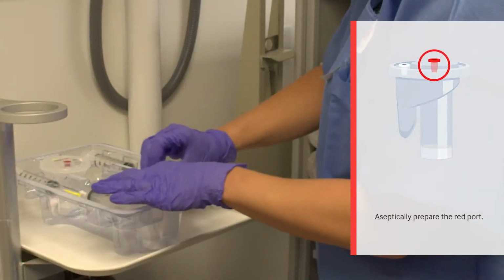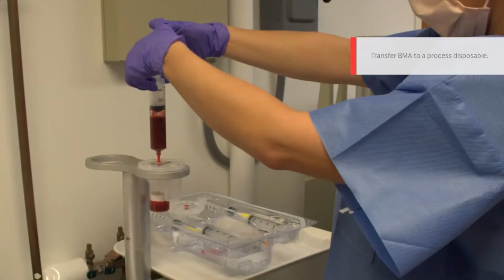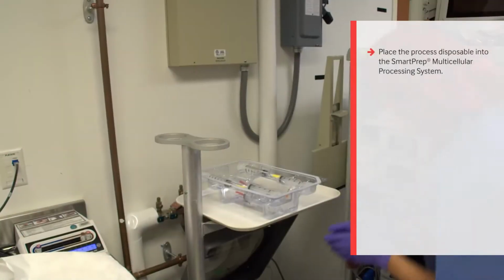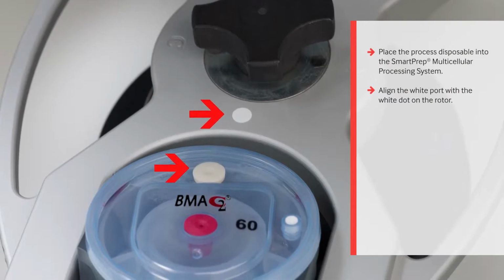Aseptically prepare the red access port on the process disposable. Next, transfer bone marrow aspirate into the red port on the process disposable. Place the process disposable into the SmartPrep system. Align the white port with the white dot.